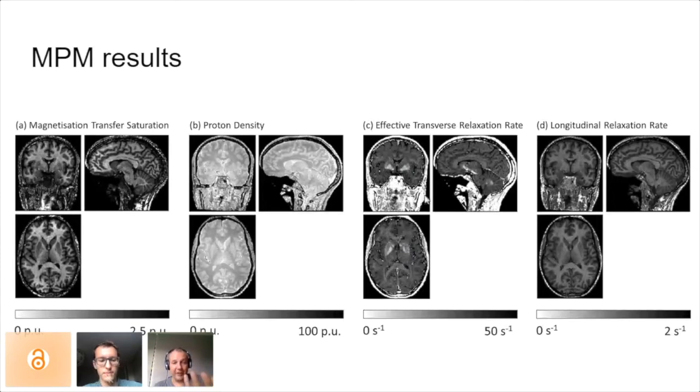And of course, because you have iron, that means your T2 becomes smaller. And if your T2 becomes smaller, that means that your 1 over T2, your R2, becomes bigger. And you have those bright spots. So this is just to illustrate one of the tissue properties that you can visualize.